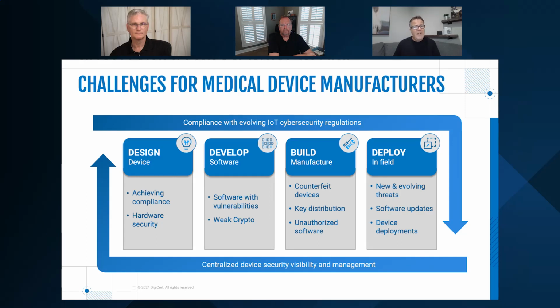And then also, ideally, do them in a way that doesn't require a lot of outage. A lot of this equipment in a hospital, in an OR room, a lot of OR rooms are booked 24/7. And so you have to book maintenance windows on some of these devices in order to apply that patch and reboot that piece of equipment. And so there's some really unique challenges to the medical device manufacturers.